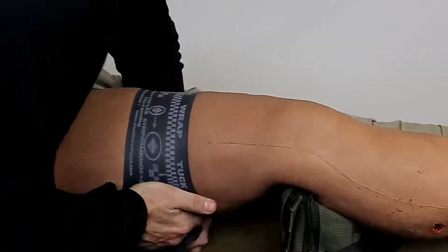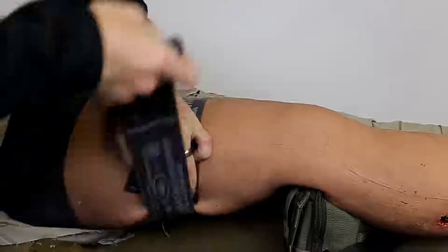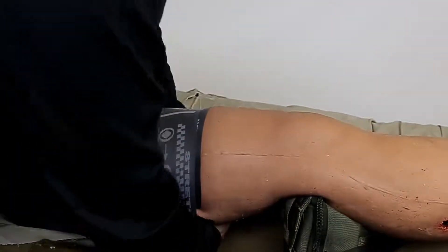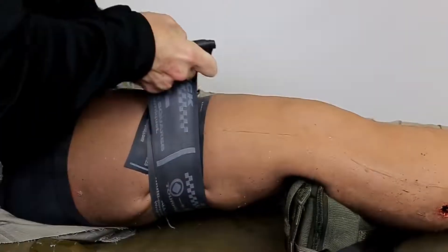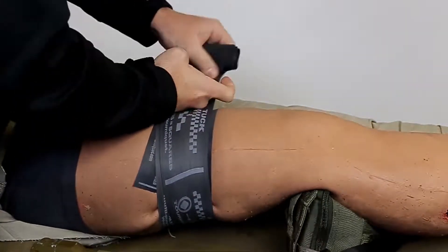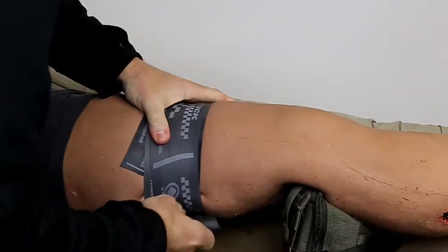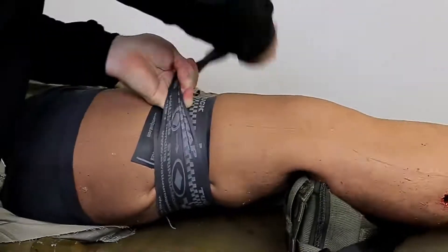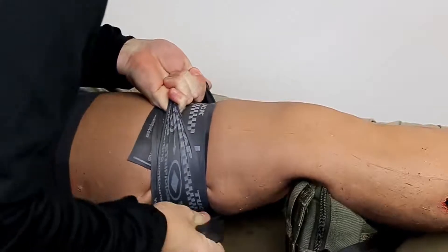When used as a tourniquet, the SWAT-T should be applied between the wound and the body, tightly enough to stop all blood flow to the limb. Be sure to overlap the first wrap of the tourniquet to secure it in place. Subsequent wraps should be tight enough to stop blood flow as shown on the pressure indicator markings. On the final wrap, remember to place your fingers underneath the SWAT-T to provide a place to tuck the tail in order to secure it.